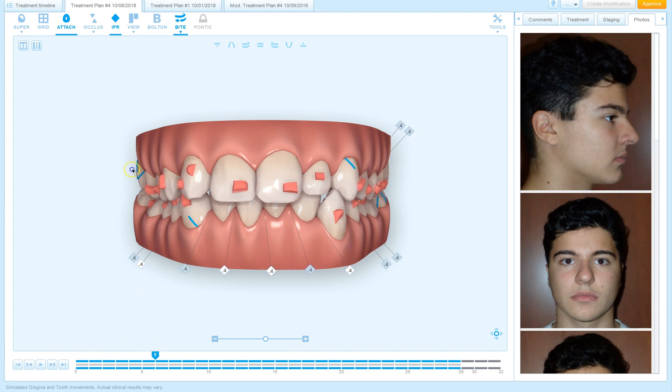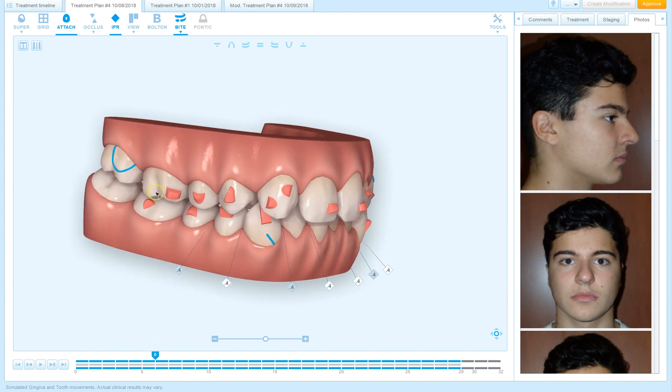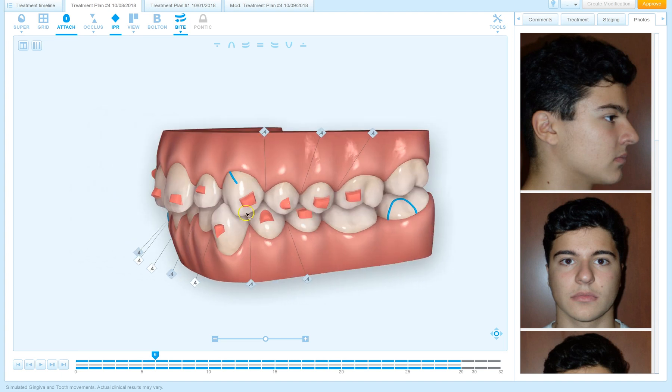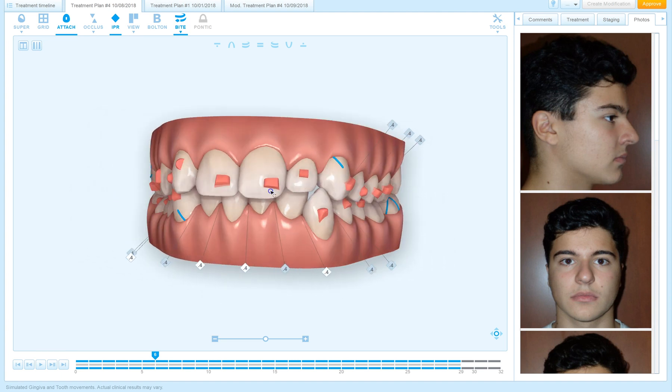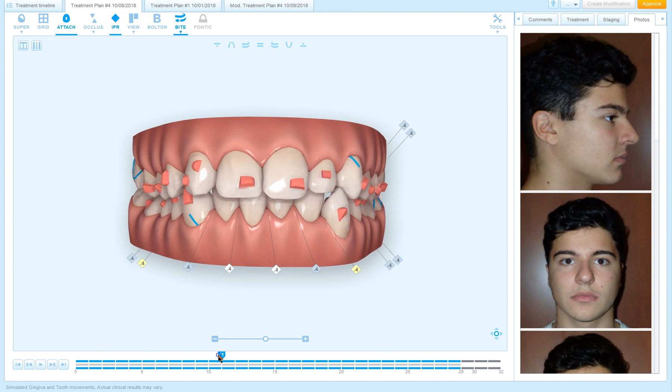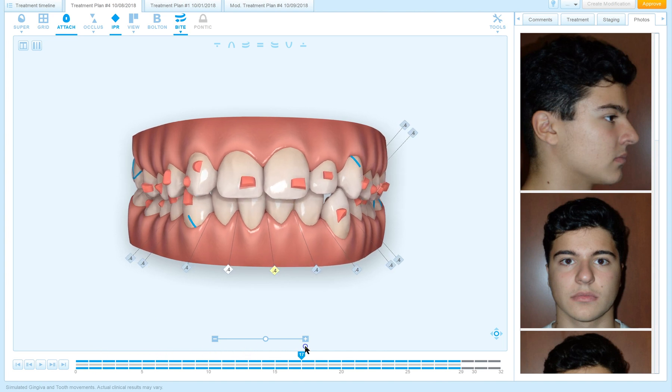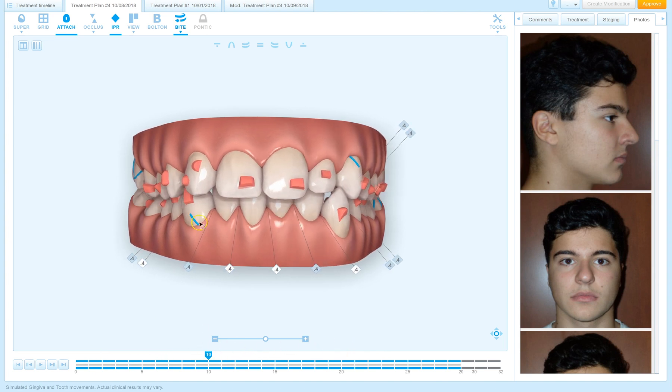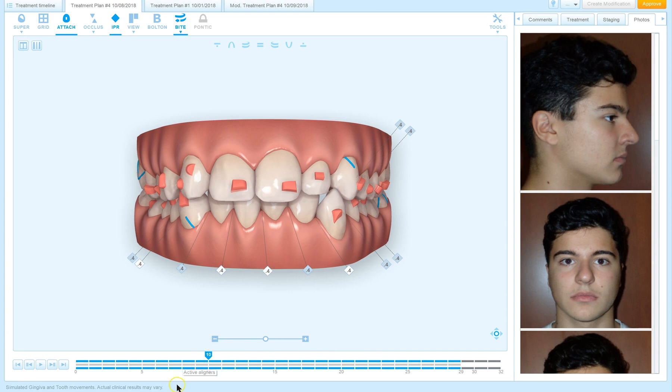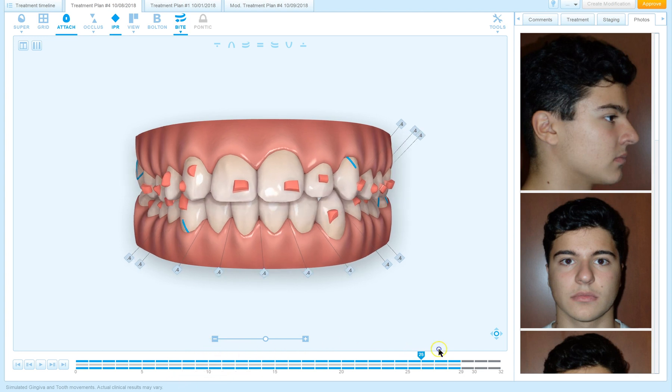Maybe class 2 elastics on the left side, maybe not. So I have them there just in case, and I've made several modifications to the ClinCheck. You can see now the lower midline is more or less staying still, the upper midline is moving over to the right.